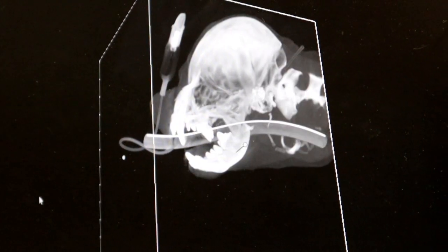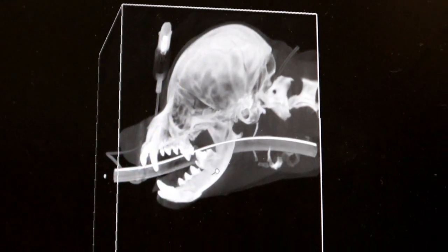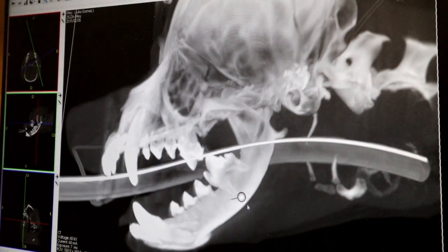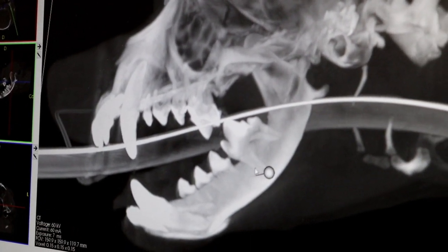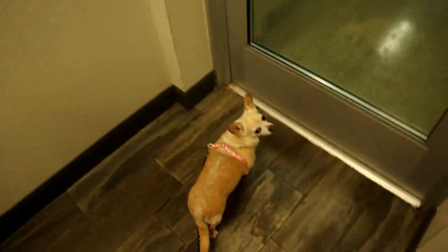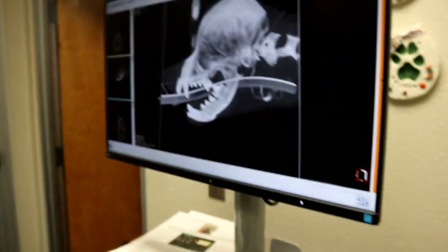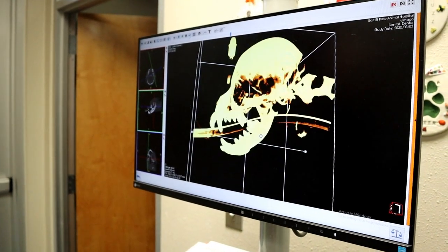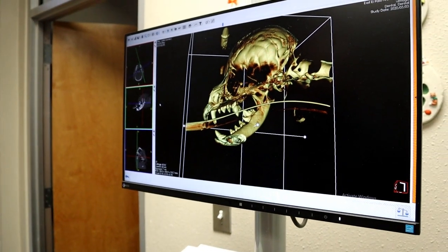I can do the same thing to the other side of the face — remove it. Now we can take a look and zoom in so that you can see those spaces around the teeth, looking for any pathology. Again, they all look really healthy.